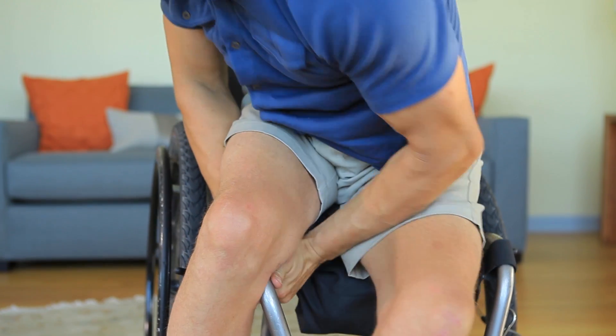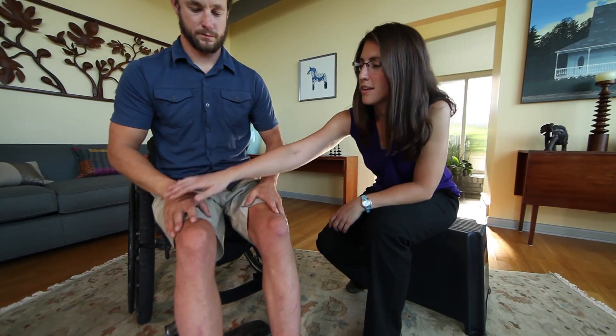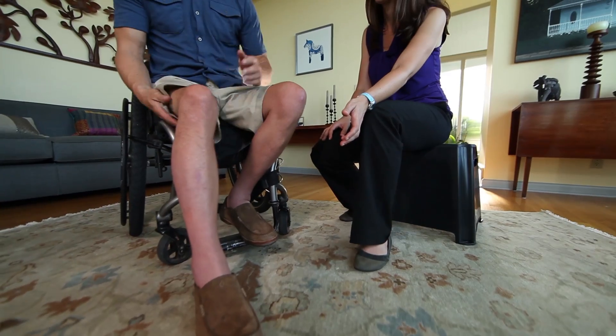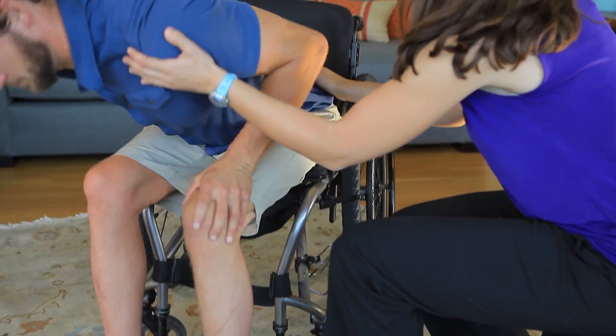However, this transfer is physically demanding and taxing on your shoulders and wrist joints. Consult with a physical or occupational therapist to explore whether you're ready to learn this transfer and help you select the floor transfer method that works best for you.